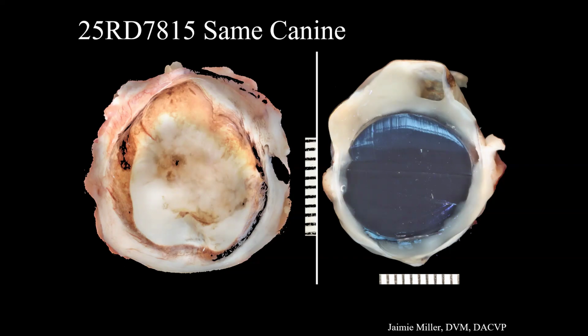And then about 6 months later, there was another development of a lesion near the dorsolateral limbus that initially improved with topical steroids, but then it enlarged and created a little bulging area. So they decided to go ahead and remove the entire globe. They do note that the other eye still has the retinal degeneration, and that they had also done a chemical ablation at some point in the past. They didn't give a specific date, so I'm not sure at what point that was done in the dog's history.